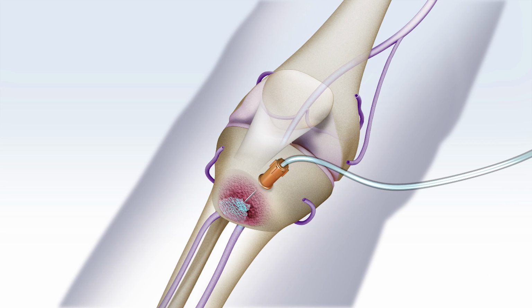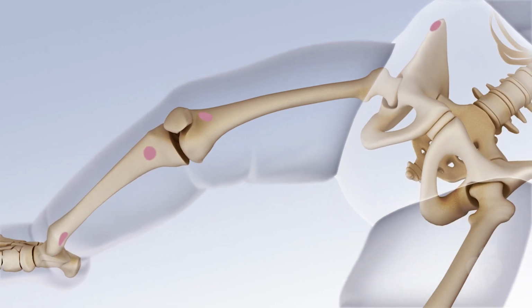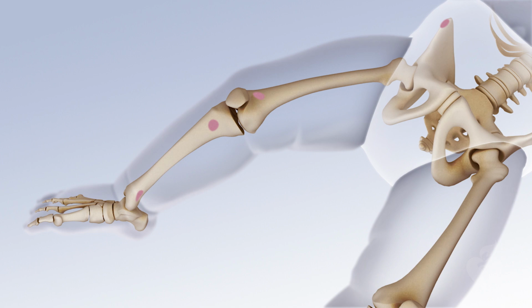After IO cannulation, providers should check the site frequently for signs of swelling and needle displacement. Remember that fluids or drugs delivered via a displaced needle can cause severe complications, such as tissue necrosis or compartment syndrome. IO needles are intended for short-term use, generally less than 24 hours. Replacement with long-term vascular access is usually accomplished in an intensive care setting.